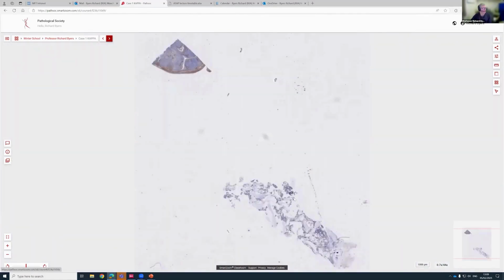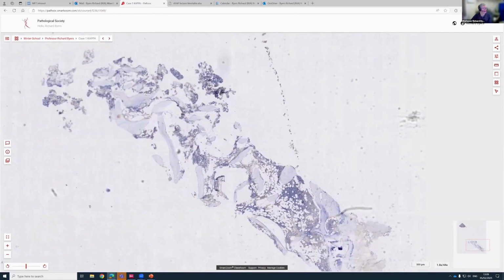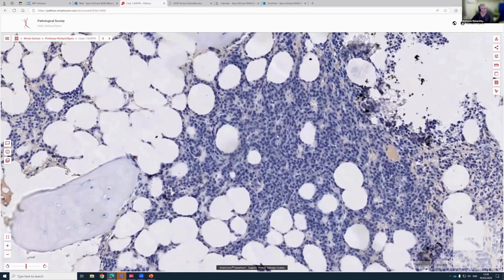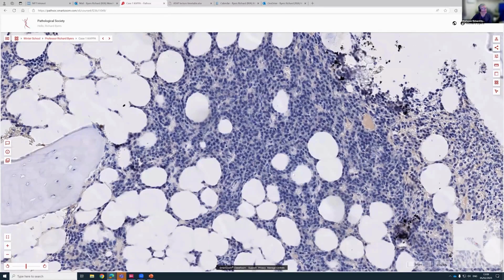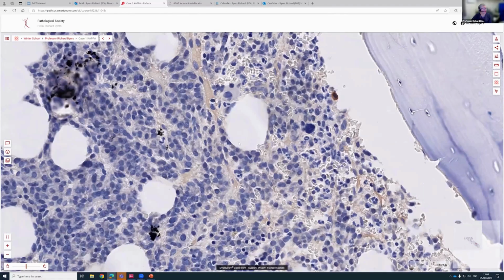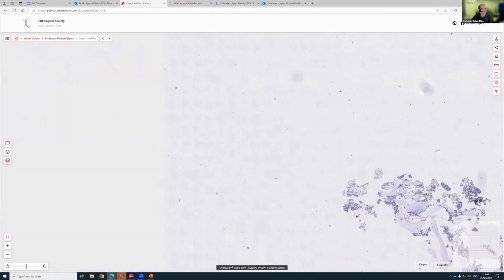You then look at the light chains. So it's important to remember that the normal serum has got light chains in it, so there will always be a little bit of background staining for whatever is the non-restricted light chain. So here we've got kappa, and it's always important to see at least a few positive cells, residual cells like that there, and always check the control. Always check the control with kappa and lambda.